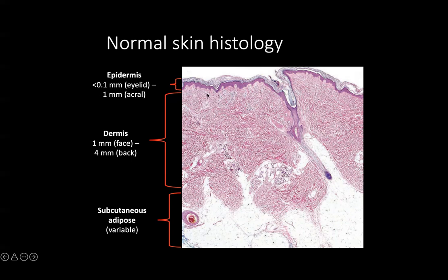Now, when you have a spongiotic dermatitis, you're going to have most of the pathology up here in the epidermis. Typically, I like to think that epidermal pathology trumps any other type of pathology when we're classifying what's going on. So if you see significant epidermal pathology, that can direct you to your differential diagnosis. You can have spongiosis within the epidermis, swelling in between the keratinocytes. You can have psoriasiform hyperplasia, where you're getting a lot of bulbous, regular hyperplasia with extension of the rete ridges going all the way down. You'll see examples of that in other lectures.